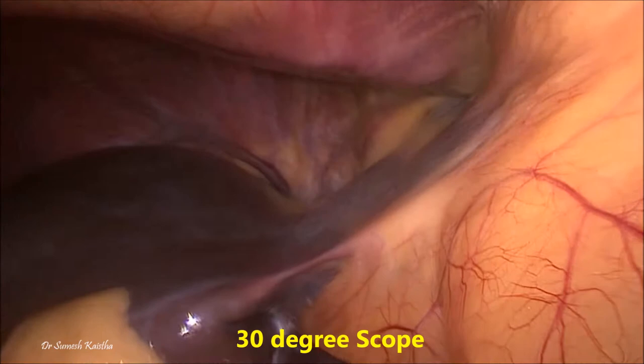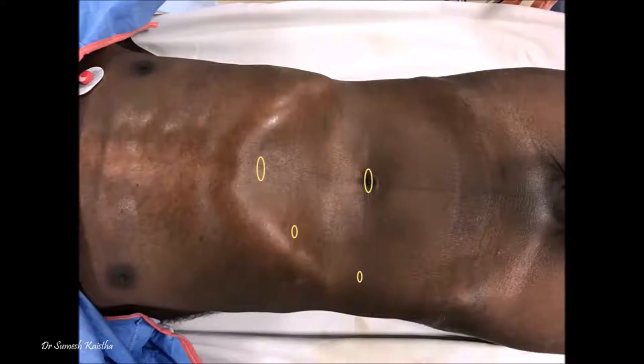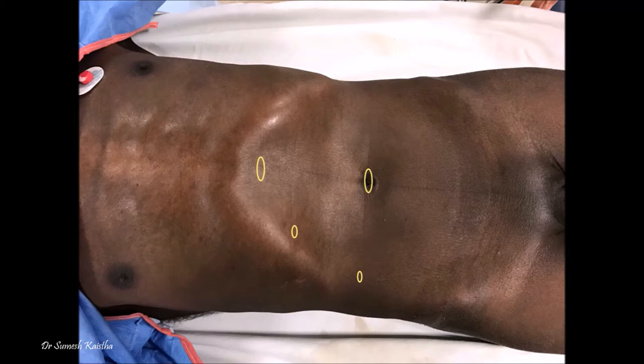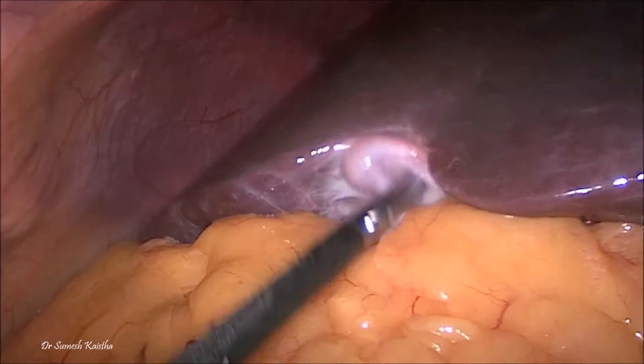Under vision, a 10 mm epigastric port is placed just below the xiphisternum onto the right side of the falciform ligament. A third 5 mm trocar is placed 2 cm below the right costal margin in the mid-clavicular line, and the fourth one in the anterior axillary line at the level of the umbilicus. This is the final port placement.